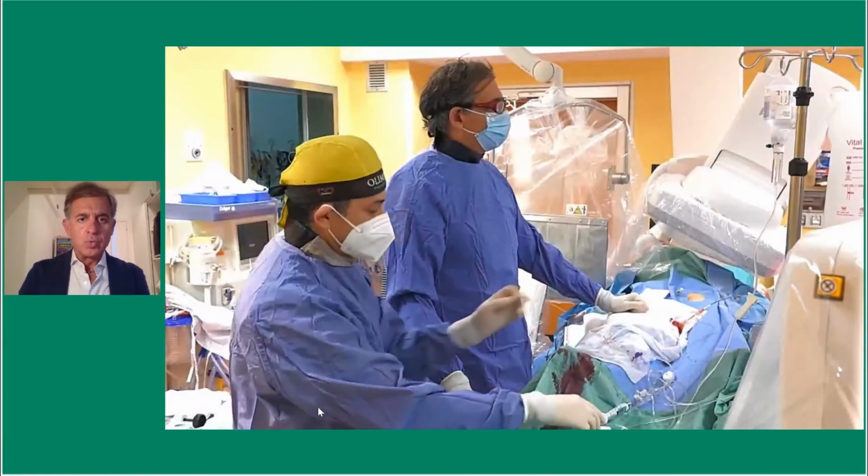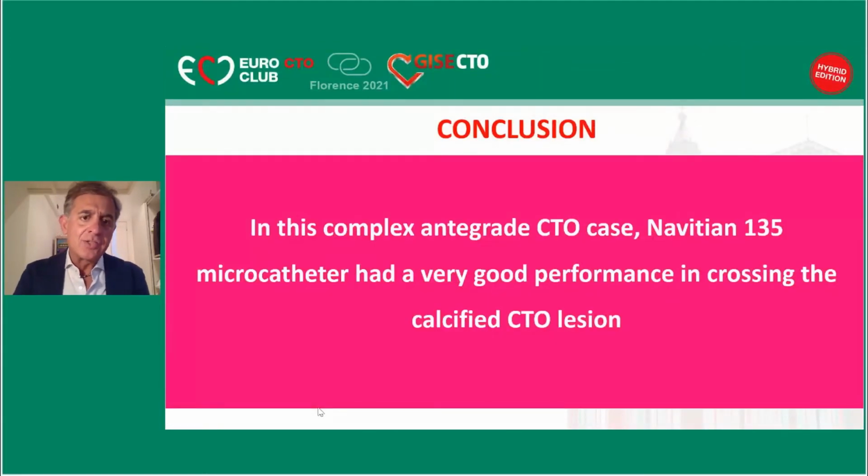So to conclude, in this complex antegrade CTO case, I was happy about the performance of the Navitian 135 microcatheter, because it has very good performance in crossing the calcified CTO lesion.